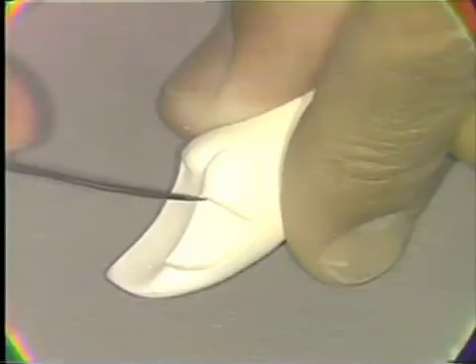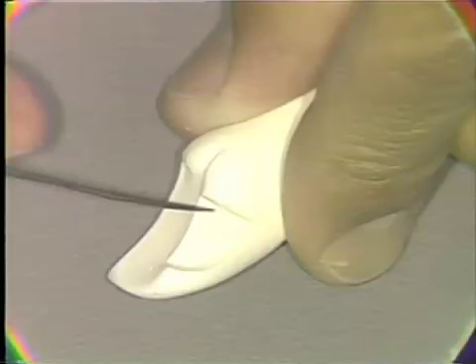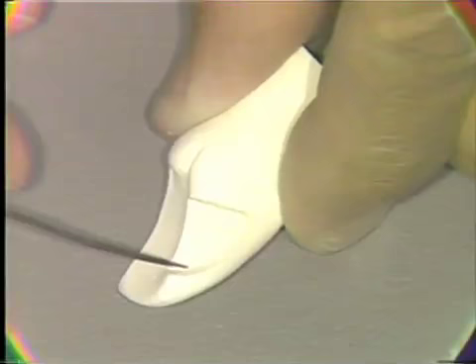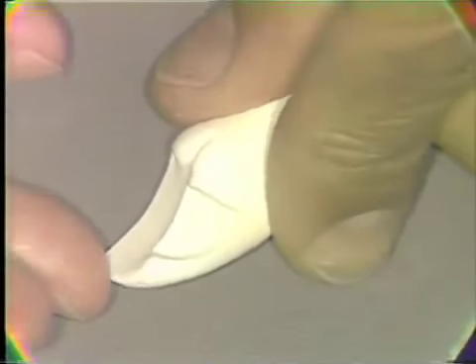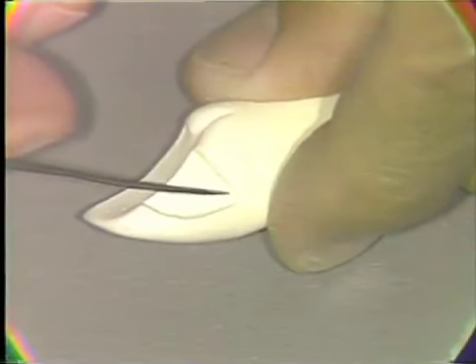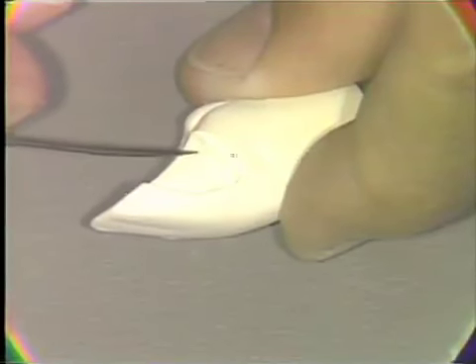This aids convenience form as well as retention form. So again, it's somewhat of a triangular shape to the preparation. The retention itself: major retention in this incisal area and into the cervical area, minor retention to the labial, and major retention in this lingual cervical position.